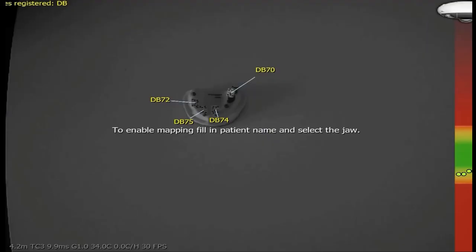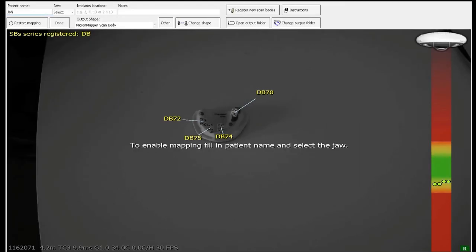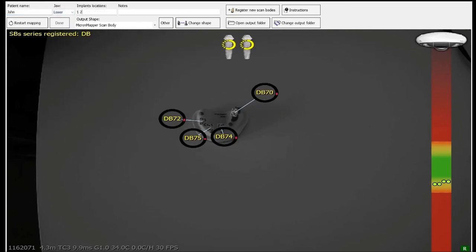In case where there are two scan bodies or abutments too close to each other and it is not possible to mount them together or if it is not possible to have them scanned together because one is hiding the other, the scan needs to be done in multiple steps. First, enter the patient's name and jaw type. Enter the implants location.